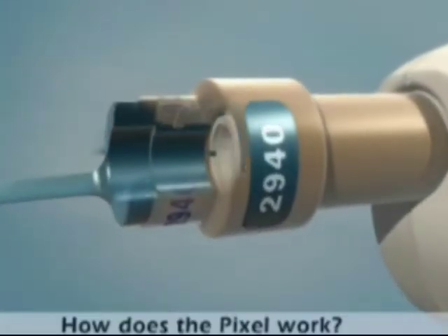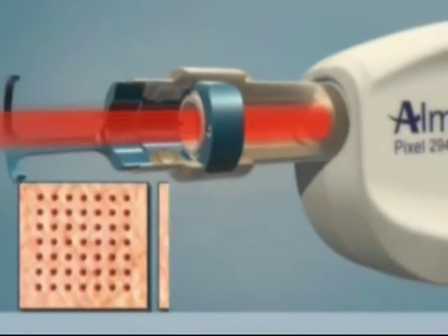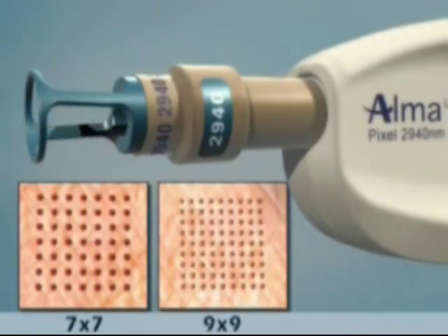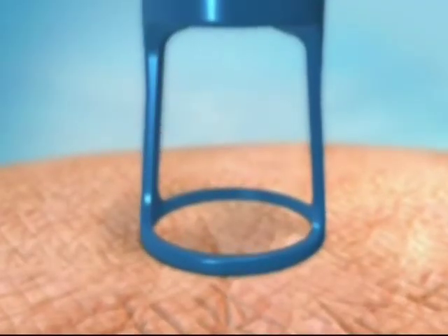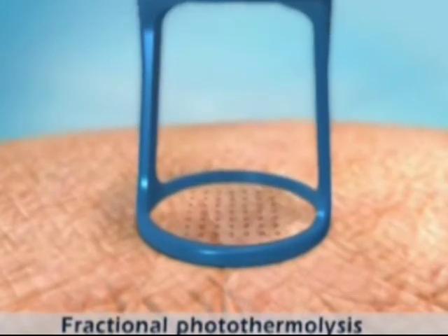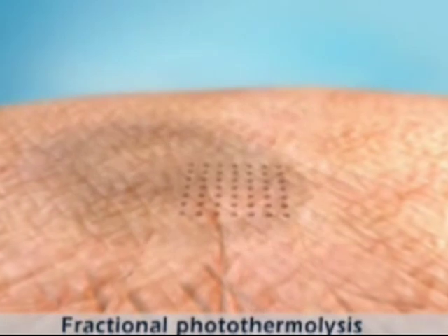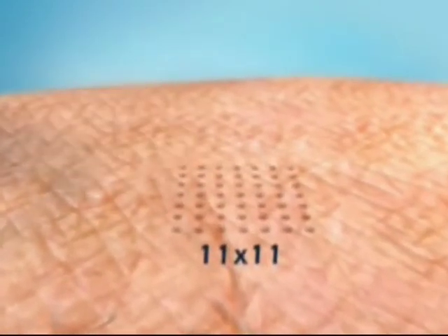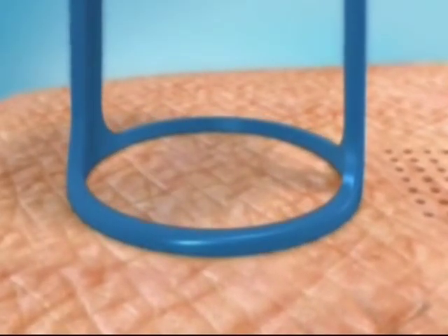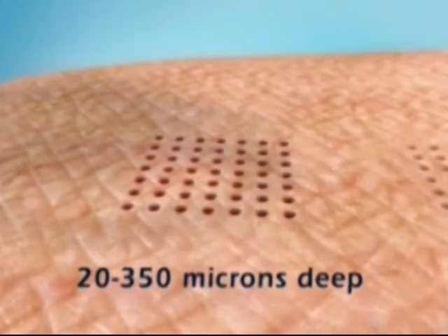Let's take a look at how the pixel works. The pixel laser beam passes through unique optics that divide it into multiple beams, arranged in either a 7x7 or 9x9 pattern. These multiple beams penetrate the epidermis and the upper dermis, creating a matrix of microscopic heat-injured zones called pixels, in an area of tissue 11 by 11 mm in size. The depth of penetration achieved depends on the number of pulses that are stacked and can be between 20 and 350 microns deep.